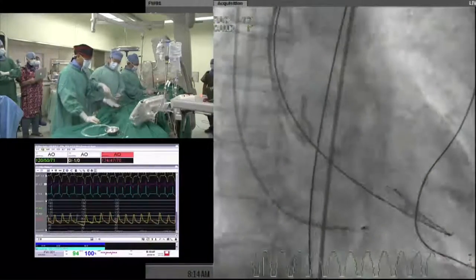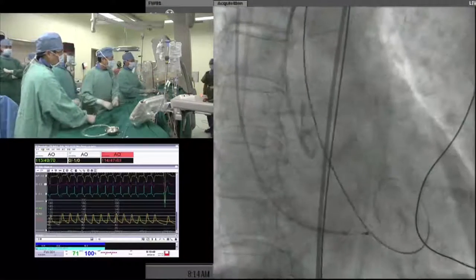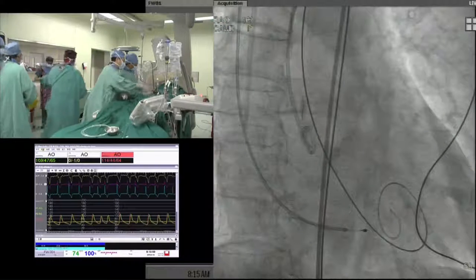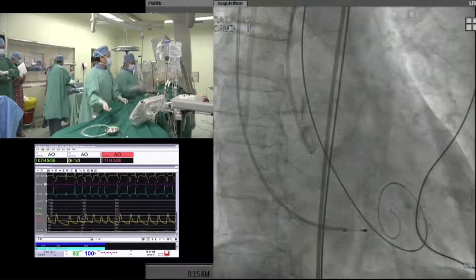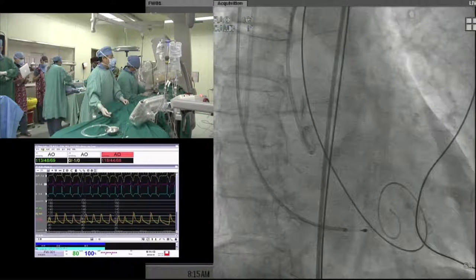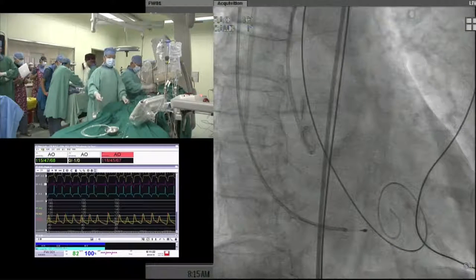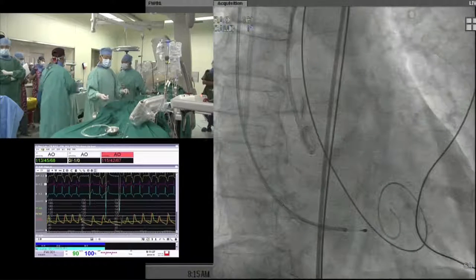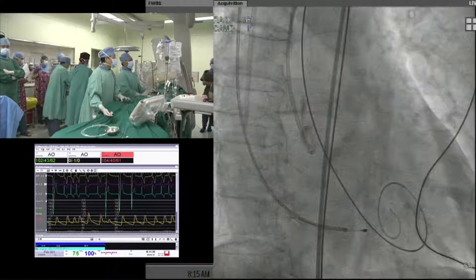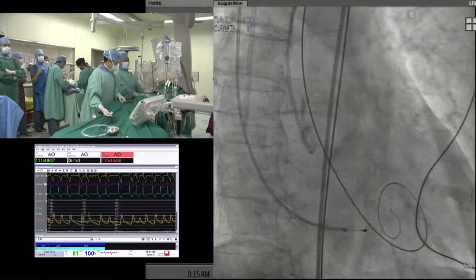So what do you think about the risk of stroke during the multiple balloon dilation? Dr. Grube, for example, recommends not to pre-dilate if the valve area is not tight. Is there any increased risk of stroke, or is that not to be considered? With repeated dilation, maybe the risk will be increased. Yeah, in the recent Lotus cohort analysis, pre-ballooning numerically increased the incidence of stroke. That is not significant because of low frequency, but numerically increased. You'd better implant the valve first and then patiently dilate due to heavy calcification. You have a chance to do a post-dilatation.